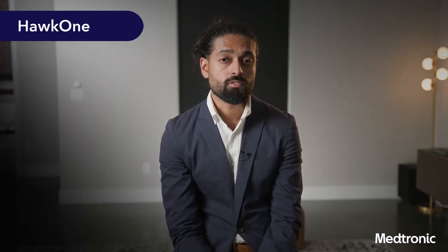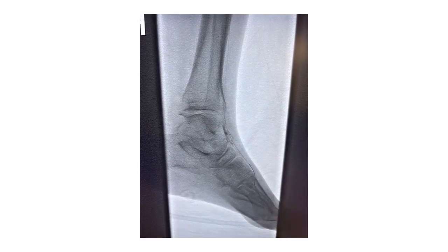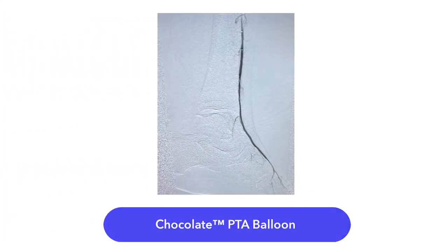In this particular case, the wound was in the dorsal aspect of the foot, and the angiogram did reveal a pretty long segment occlusion of the distal anterior tibial artery. We were able to get across, and once we got across, I used a HawkOne S. We were able to do multiple rounds of atherectomy followed by Chocolate angioplasty, and the results were fantastic.